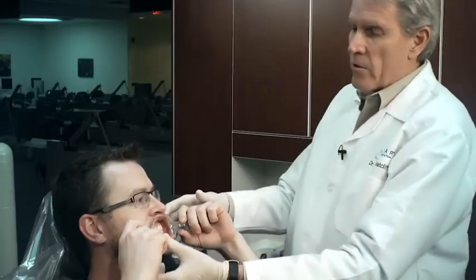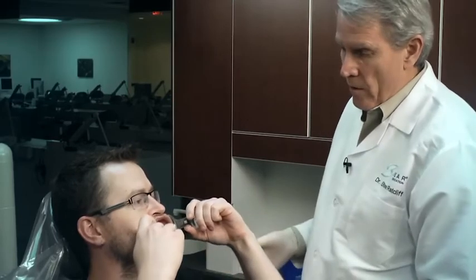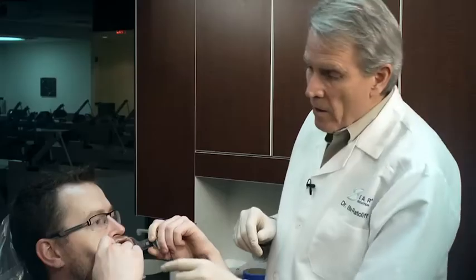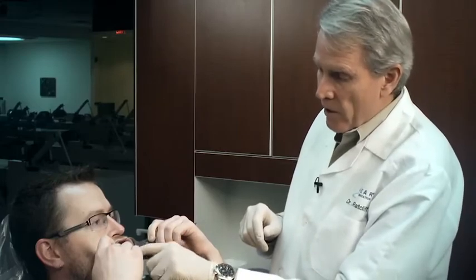Okay. So Scott, if you would pull out and forward. And now I want you to separate your teeth a little bit. Just a little bit more. A little tiny bit more. Okay. Now I've had Scott open his mouth. What I want to be able to see, as Scott has his mouth open here, is the tops of all of his teeth in the lower arch. That gives me a couple of views. It allows me to see the arrangement of his lower front teeth compared to his upper front teeth. It also allows me to see the plane of his bite on the lower arch.